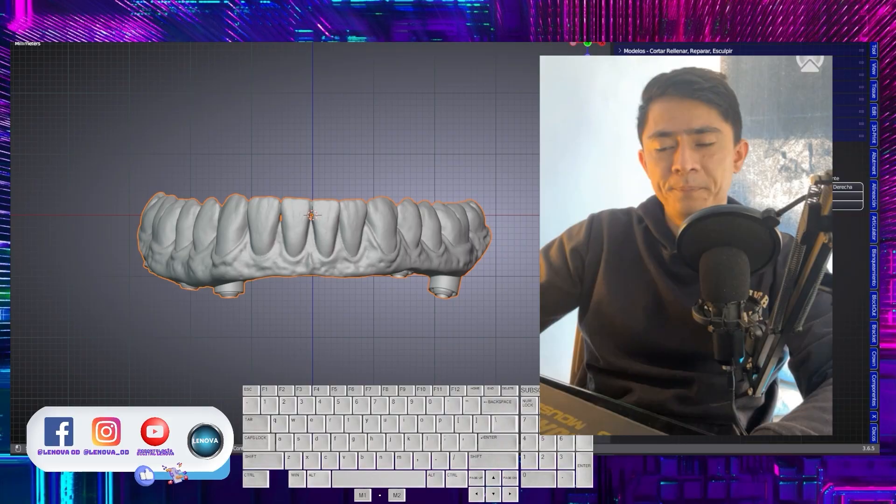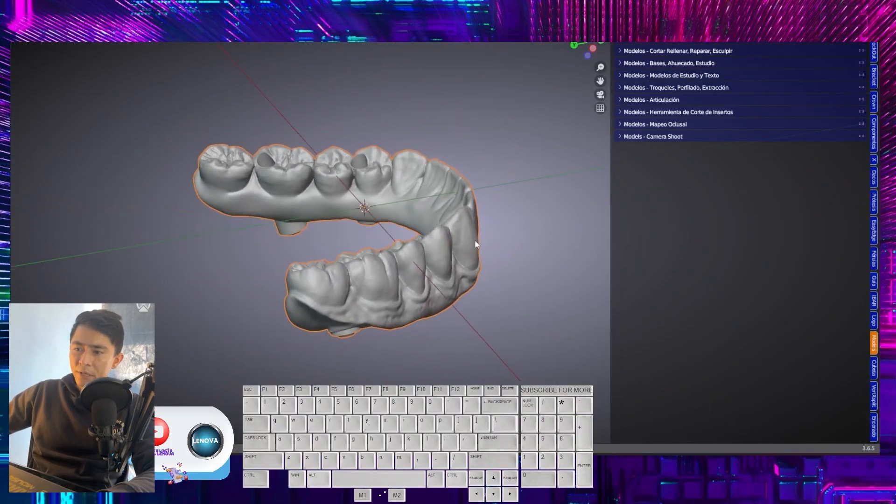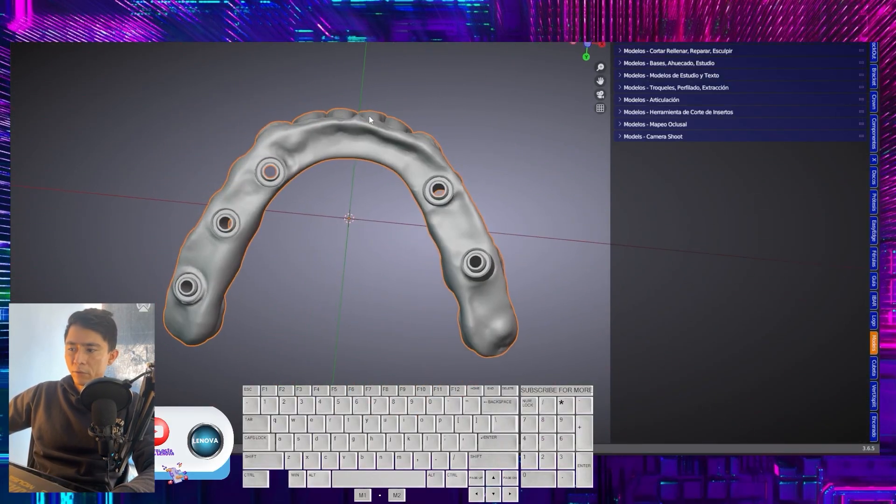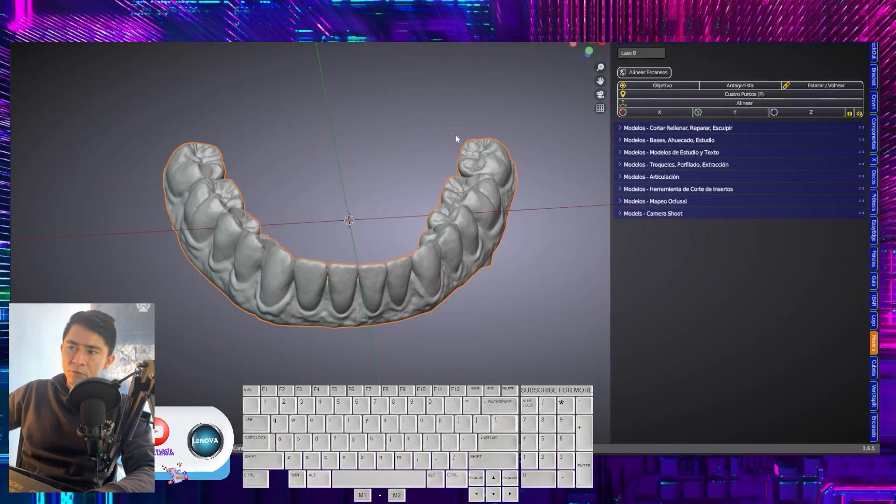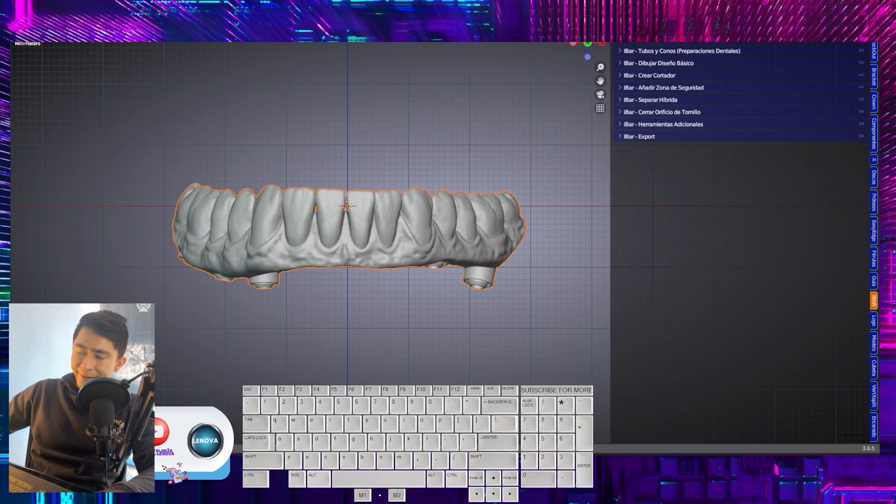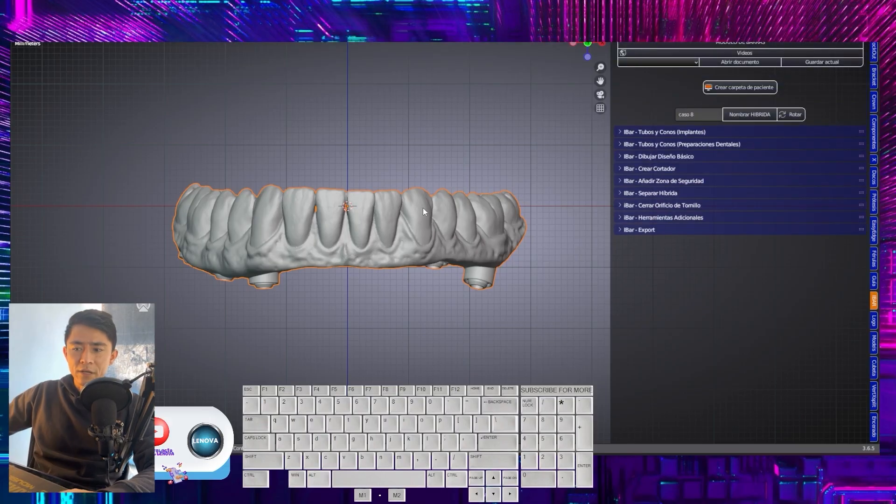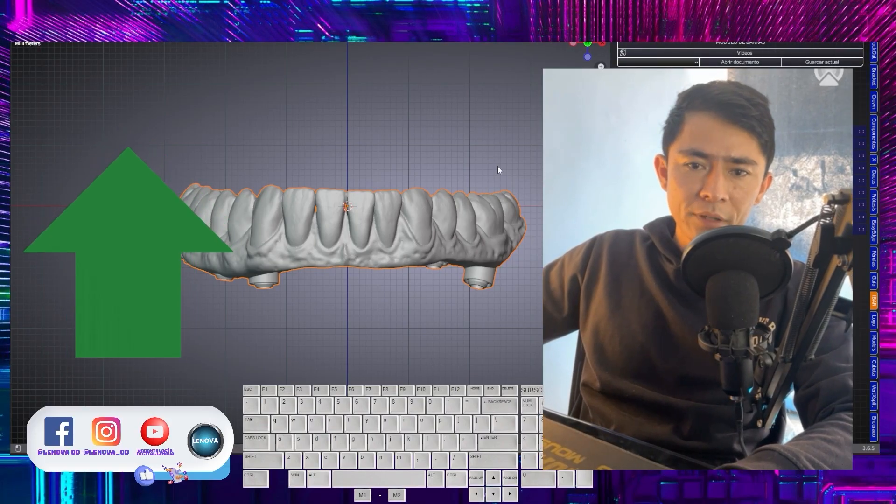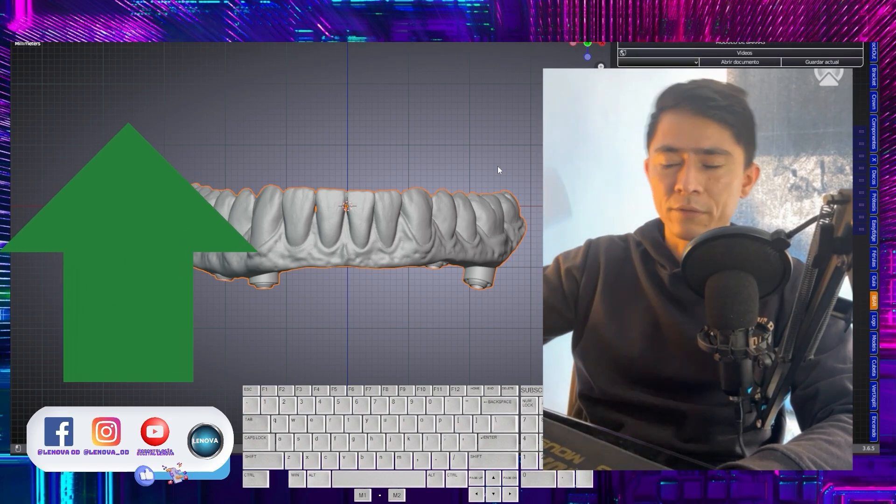In this case, we are going to work with a prosthesis that will have five chimneys. The first step will be to import the file. We will go to the iBar module. Let's fold the first tab, select the prosthesis, and assign it a free name.